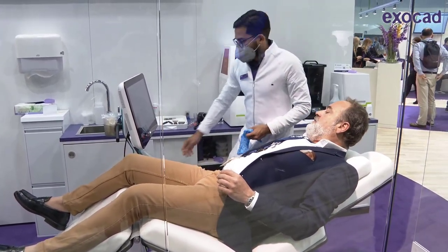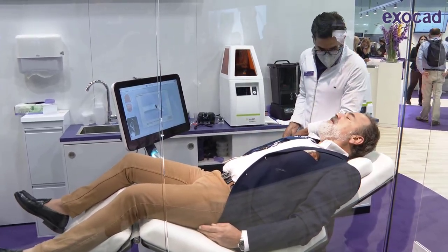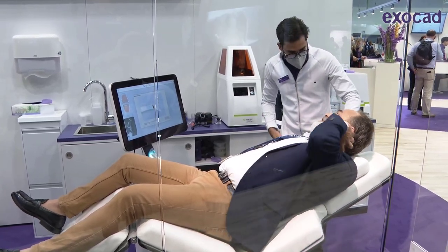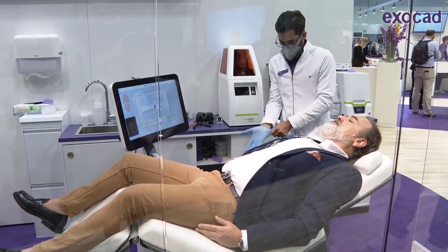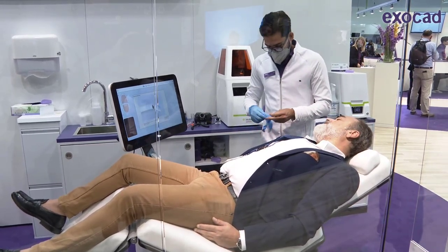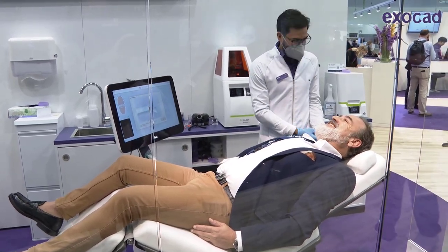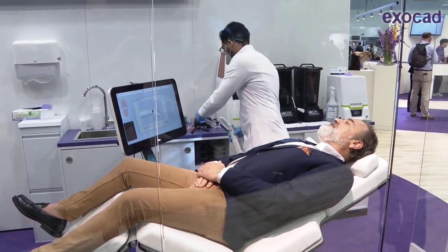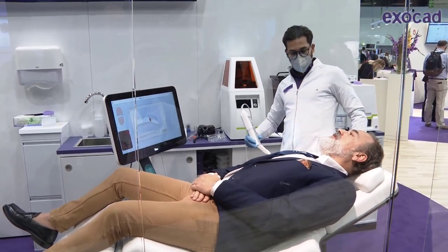We will need gloves and a mask. No further preparation is needed for the scan process — it's quite intuitive. You don't need any special courses or education to start a scan. From iTero and Align Technology, we will provide a complete set of trainings, but scanning itself can be done by anybody in the clinical practice.